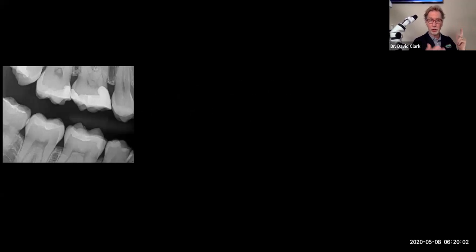So here's the post-operative radiograph that was sent from her previous dentist. I want you to look at the way that they burrowed in laterally to remove all the decay, because that's what good dentists do. They burrowed into her tooth. They took out an old composite that was fine. She had no pain. And the doctor said there's decay, your doctor left decay. So the new doctor, doctor number 2, went in and burrowed in there. What is the clearance between that composite and the pulp?